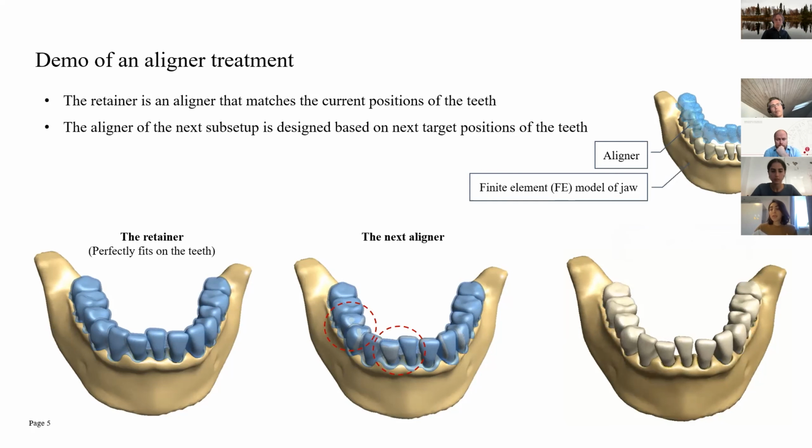Here I'm magnifying the displacement of the teeth so that you can easily see how the teeth are moving based on our plans. But we are going to do more work on this project because it's a sub-project of our work, and I won't go into details about the precision of the teeth, whether they are moving properly or not.